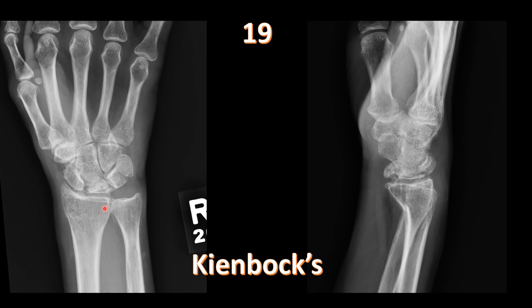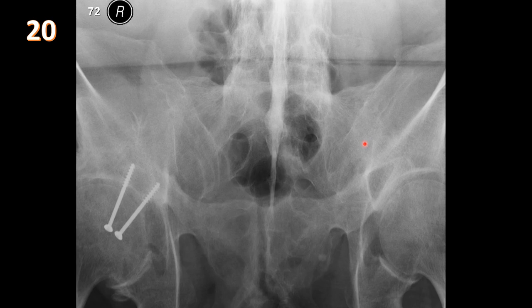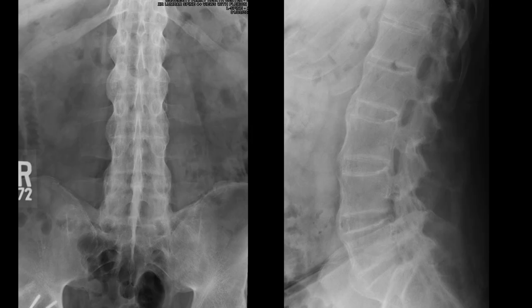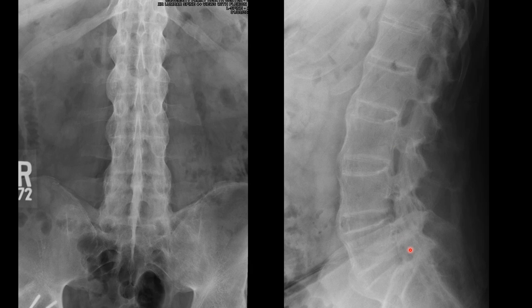AP view of the sacroiliac joints shows fused sacroiliac joints, calcification of the interspinous ligaments, and fusion of the lower lumbar spine. AP and lateral views of the lumbosacral spine confirm syndesmophytes — calcification of the fibers around the intervertebral disc — and fusion of the facets, producing the classic bamboo spine appearance of ankylosing spondylitis. Bilateral symmetric sacroiliac involvement is seen in ankylosing spondylitis and IBD-related seronegative spondyloarthropathy; bilateral asymmetric involvement is seen with psoriasis and reactive arthritis.